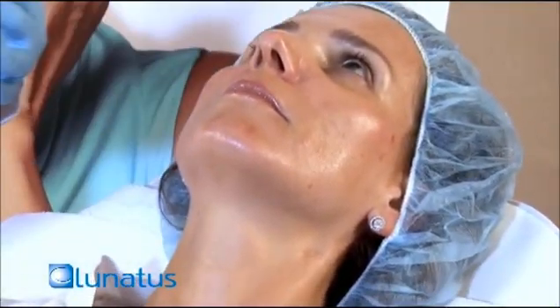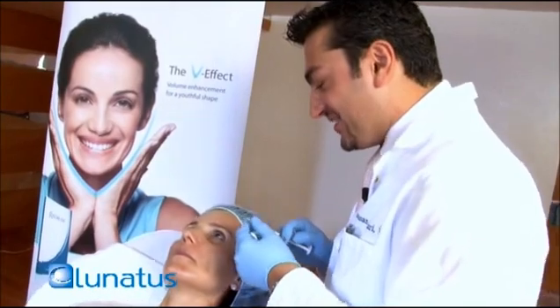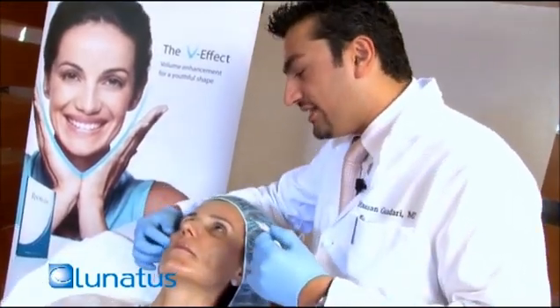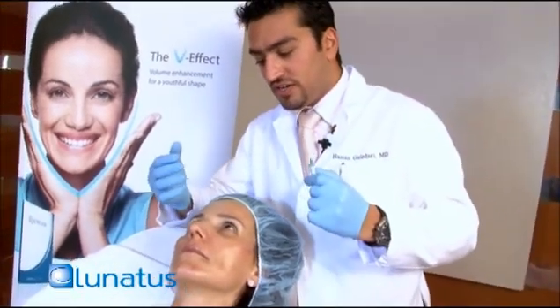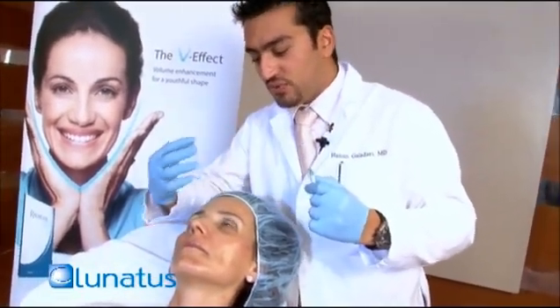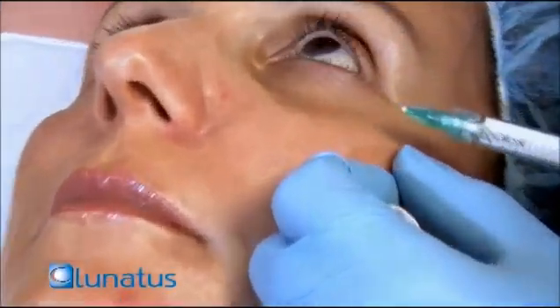All right, Roberta, I'm going to ask you to sit up for me. This one is still over here. It's kind of sunken down, but this one is much less diminished. So now we're going to be injecting the left side, and it's going to be very similar to the right, and you want to try to compare it. The easy thing is that you just move to this area, you can see it from this point of view, and then you can go back and insert whatever product you need the most. All right, so it follows the same technique.